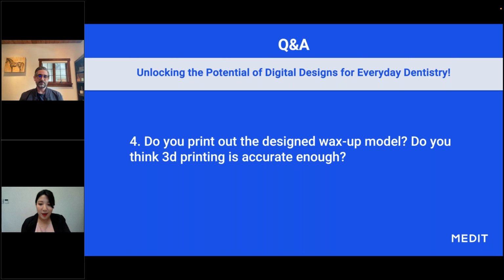Yeah, we've got this kind of question a lot from the users. I mean, like I said, I experimented with it. I would take a backup impression and check these things, but you get to a point where you lose that sort of fear, because once you see it enough... And I do think when you start, you have to calibrate your staff, your printer, everything. So it's always good to ease into it, but there are a lot of different workflows out there, and a lot of different people using these printed models for everything from the mock-up to the final design.